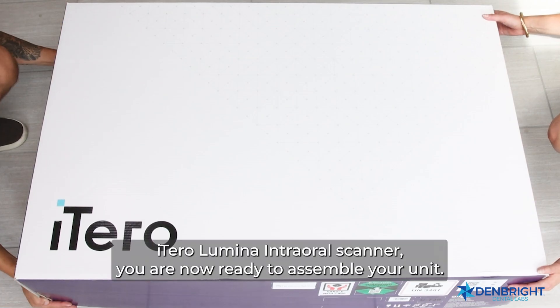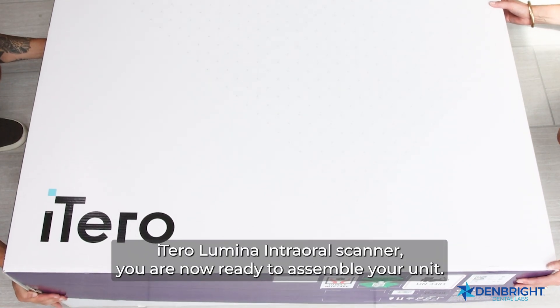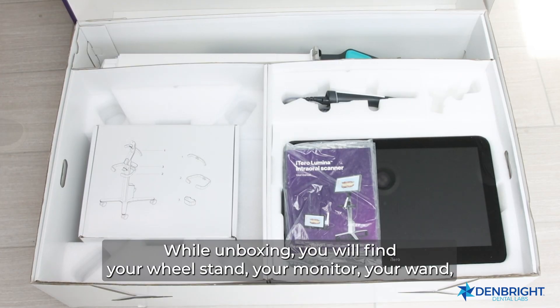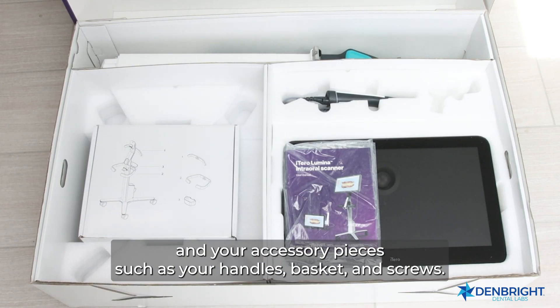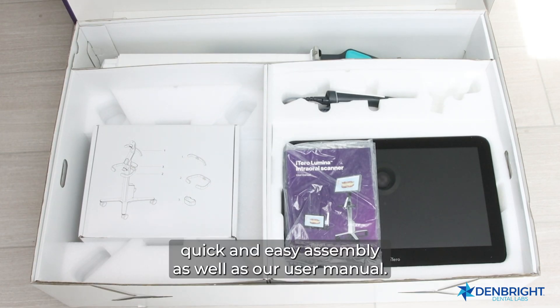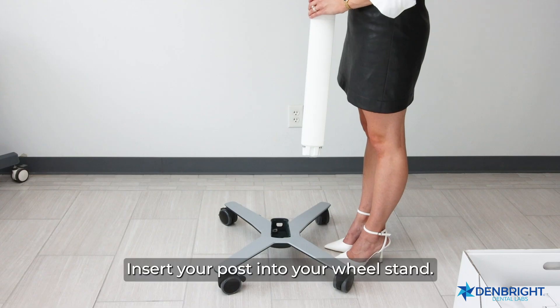Upon receiving your new iTero Lumina intraoral scanner, you are now ready to assemble your unit. While unboxing, you will find your wheel stand, your monitor, your wand, and your accessory pieces such as your handles, basket, and screws. Additionally, you will find a user guide for quick and easy assembly as well as a user manual.